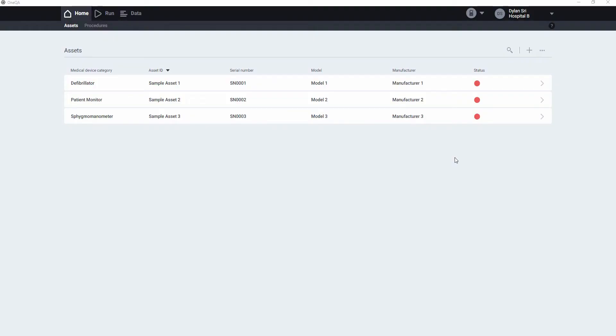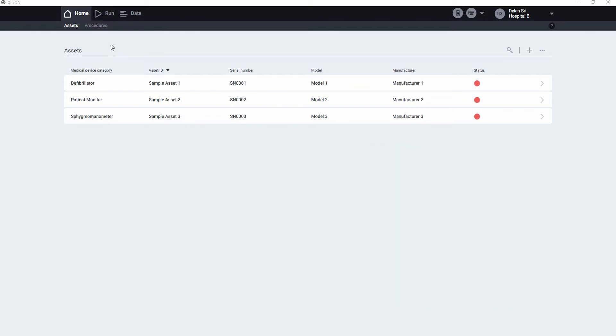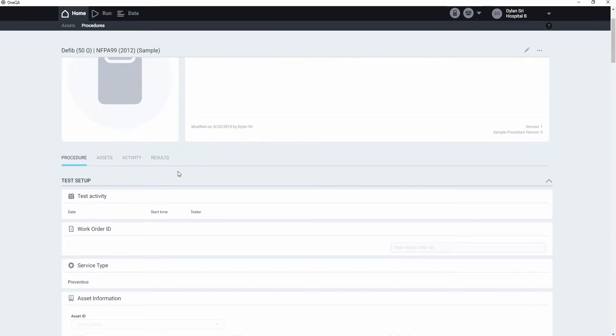We're going to walk through a test on a defib, executing an integrated workflow using an ESA and an impulse. Here's our defib. So here we are on our home screen. We're going to navigate to procedures, and today we'll run this NFPA 99 sample procedure designed for a defib.